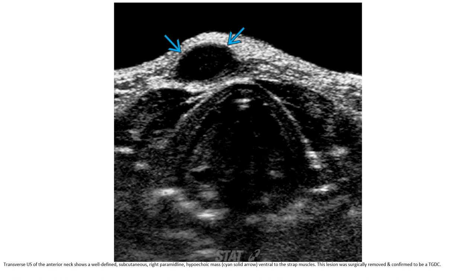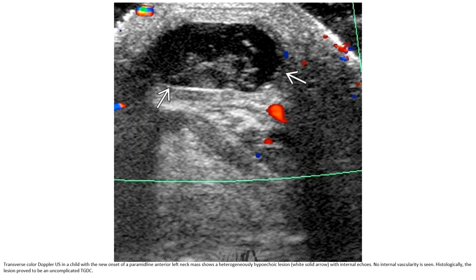This is an ultrasound of the anterior neck showing a well-defined subcutaneous paramedian hypoechoic mass ventral to the strap muscle. The lesion was surgically removed and confirmed to be a thyroglossal duct cyst. Color Doppler ultrasound in a child with new onset paramedian anterior left neck mass shows a heterogeneously hypoechoic lesion with internal echoes and no internal vascularity — consistent with uncomplicated thyroglossal duct cyst.